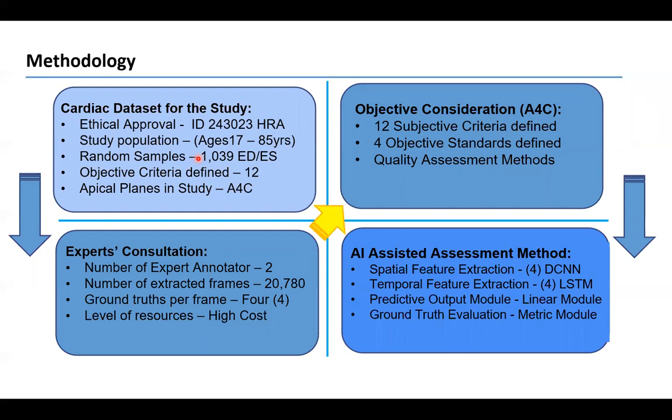In our studies, we adopted a methodology where we obtained the cardiac data set for our study. Also, we made expert consultations regarding the features paramount to cardiologists, clinicians, and operators, and we were able to have a rating based on visual assessment, a quality rating for each of the cardiac frames we obtained.